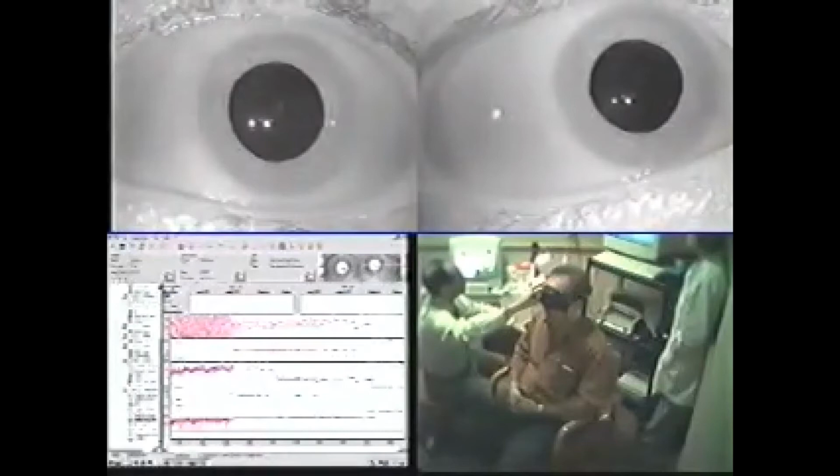As previously stated, in a case of 2 healthy ears, the input from each is equal and therefore will not elicit any post-headshake nystagmus. The same is true for a bilateral peripheral dysfunction. Since both ears are sending the same amount or no information to the vestibular nuclei, then the signals are equal and will not cause a post-headshake nystagmus.